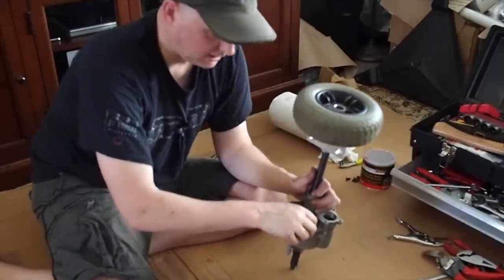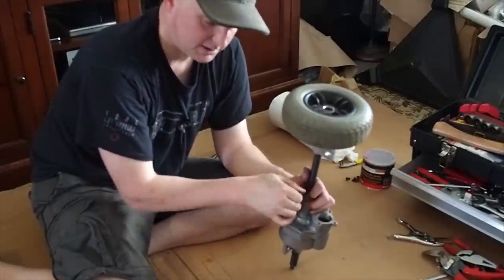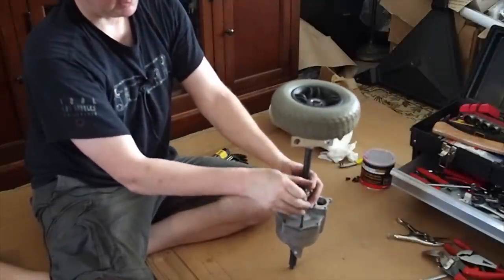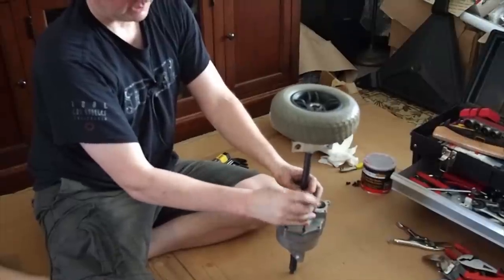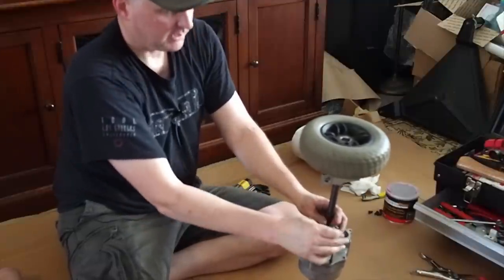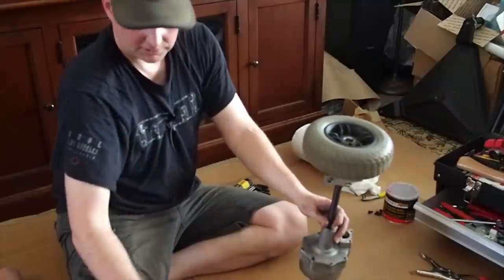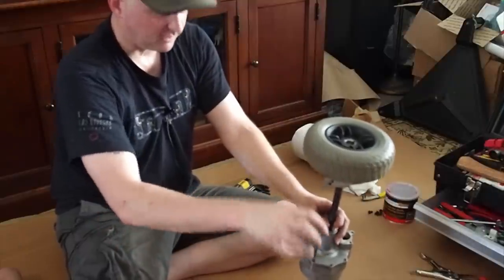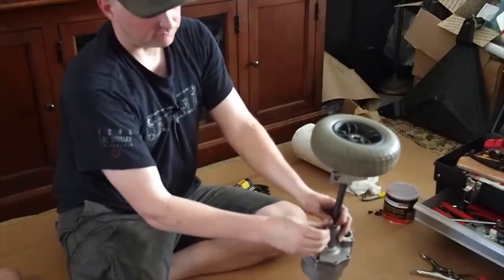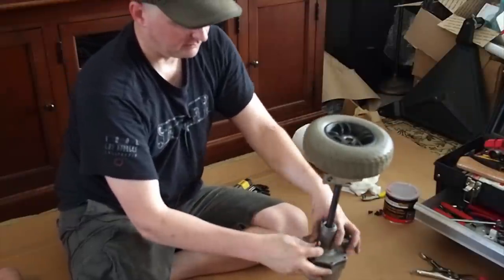The difference between a transmission and a transaxle has to do with the way the gears are positioned. With a transmission, the drive shaft comes down to the transmission, and then the transmission goes to the wheels. A transaxle is right off of the motor, and it goes directly to the wheel. So you always seem to have transaxles.